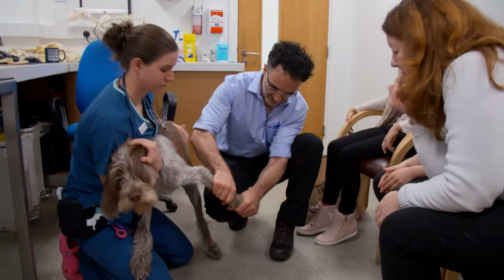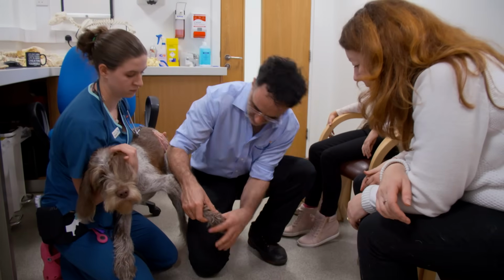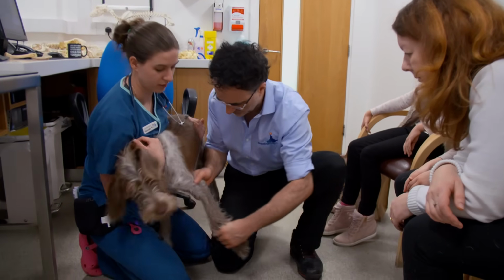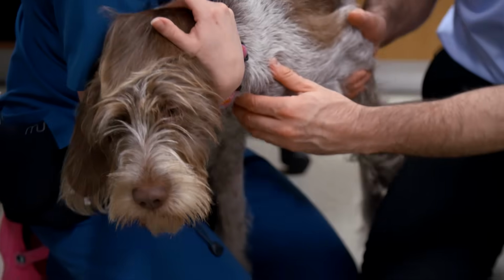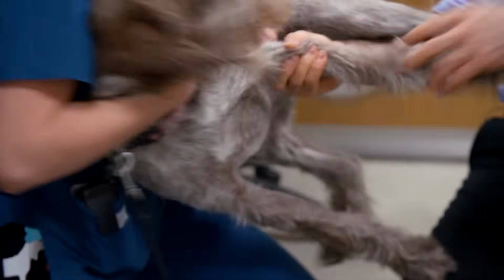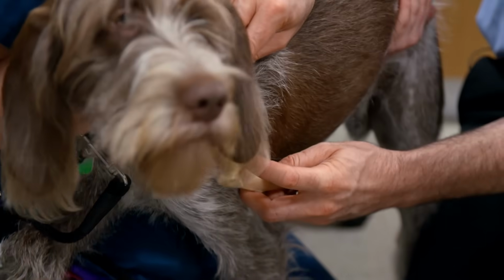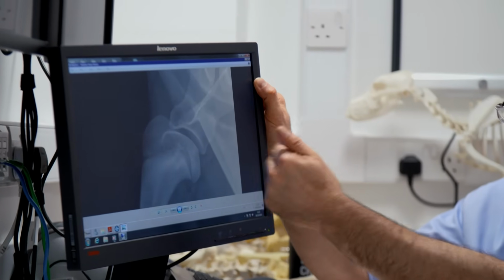Now the wrist is probably fine. The toes are probably all fine. The elbow probably also is fine. And I'll only do this briefly. Usually it hurts in that position there. Good girl, well done. Okay, that's fine. It's because there's raw bone here. Right. So there's a big hole which is a bit like a crater on the moon. That is the surface of the joint flaking away.